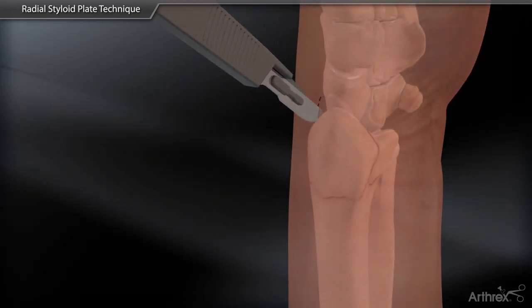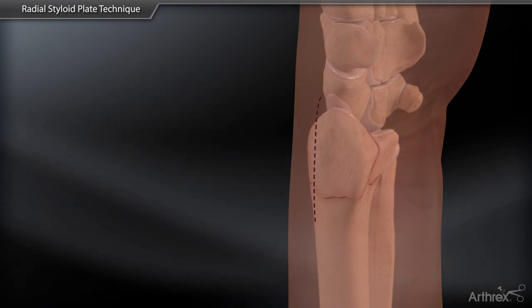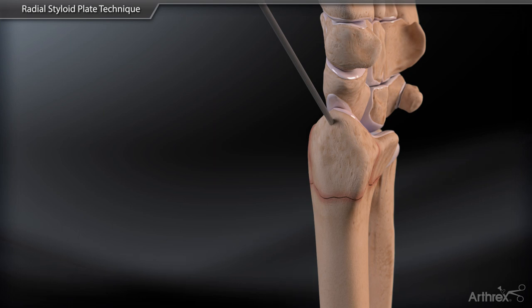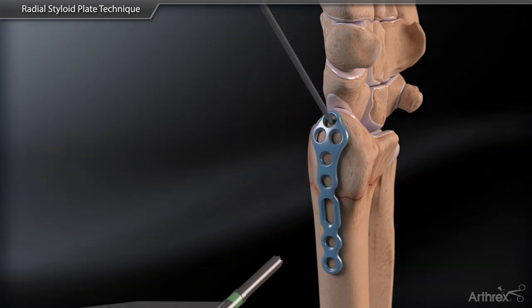A linear skin incision is made along the mid-axis of the forearm at the level of the wrist on the radial side. A transtyloid K-wire can be placed distally through the fragment to reduce the fracture and provide a guide for plate placement.